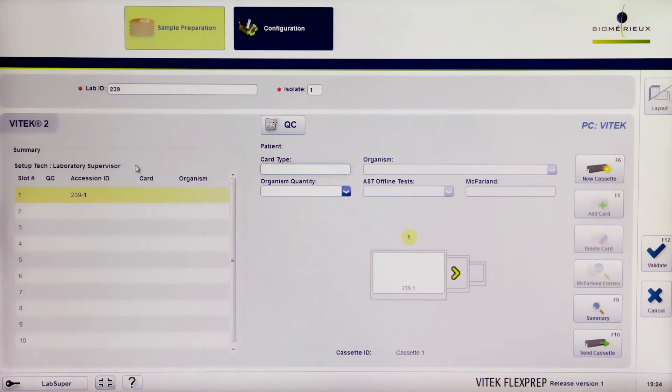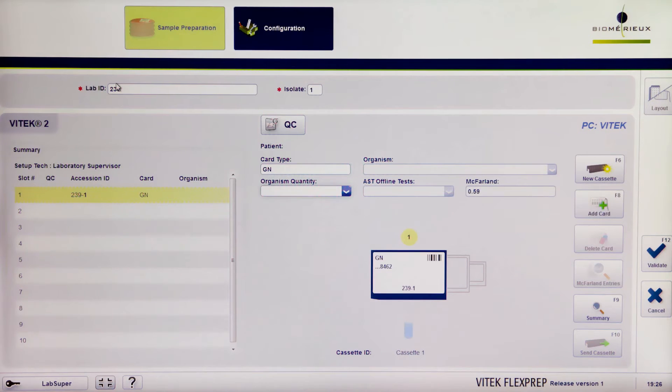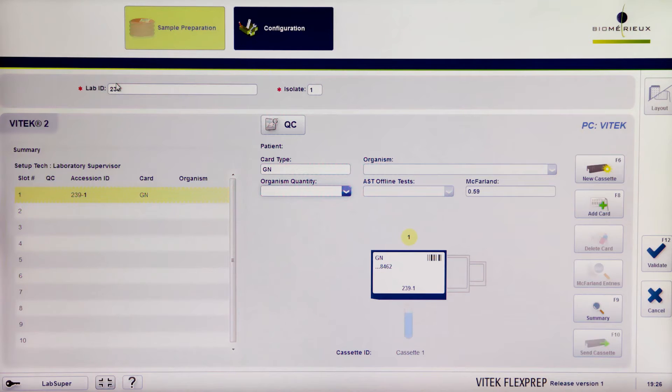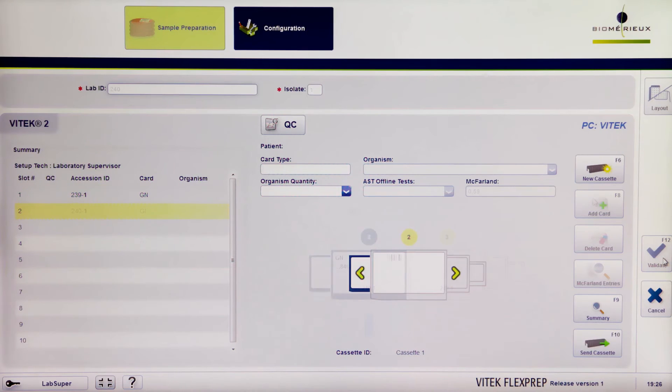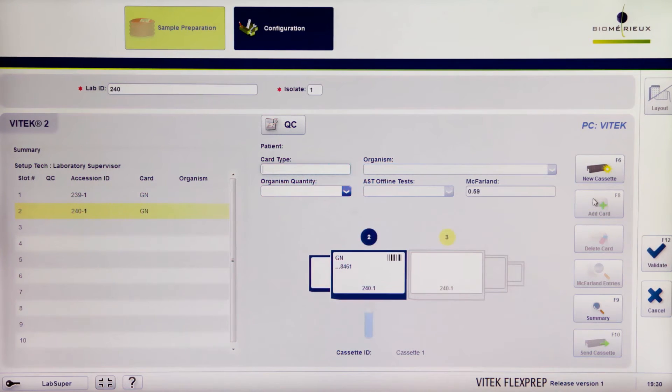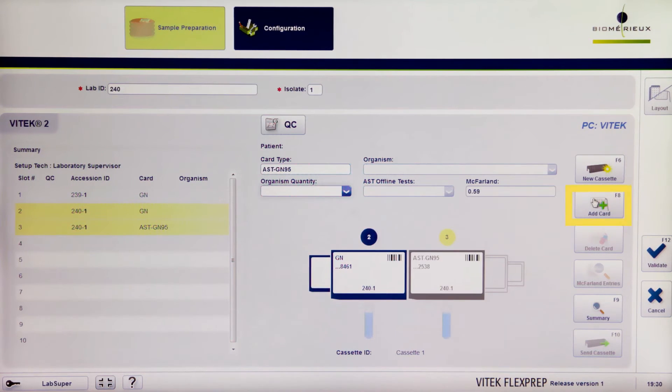Enter isolate and card information for the first card, in this case the ID card. If this is the only card in the isolate, double-check all entered information is correct and click Validate. Otherwise, click to add another card, for example, an AST card.